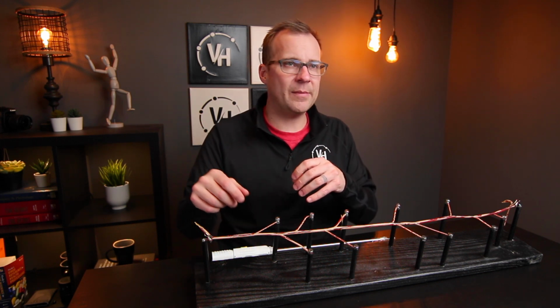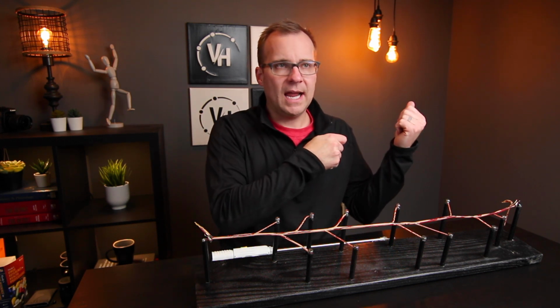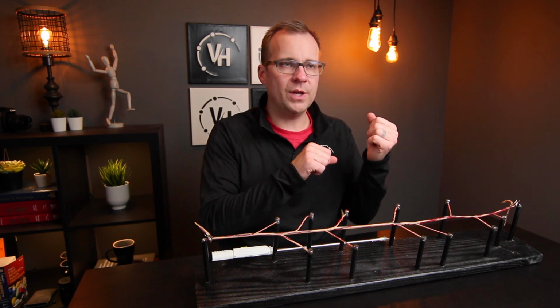Under dissection at the knee usually leads to a situation where, once you're done with your harvest, you've done your stab and grab, you're ready to pull the vein out, and you come back to the knee, what you see coming out of the leg seems like it's tethered. So you put a retractor in, you look, and boy, just out of reach of that retractor is more connective tissue. And now once the vein is out and it's kind of floppy, it's laying in your way, that becomes a lot more difficult to dissect.